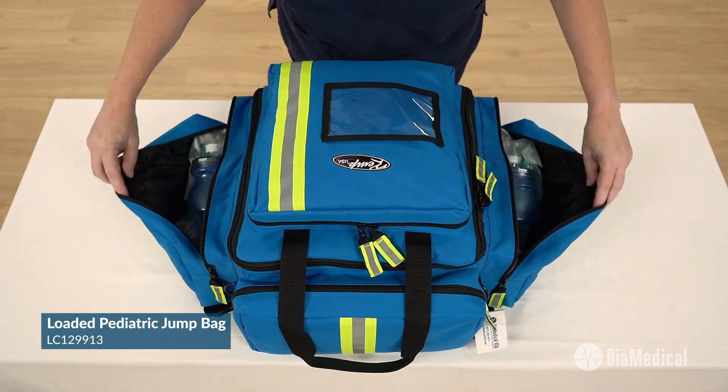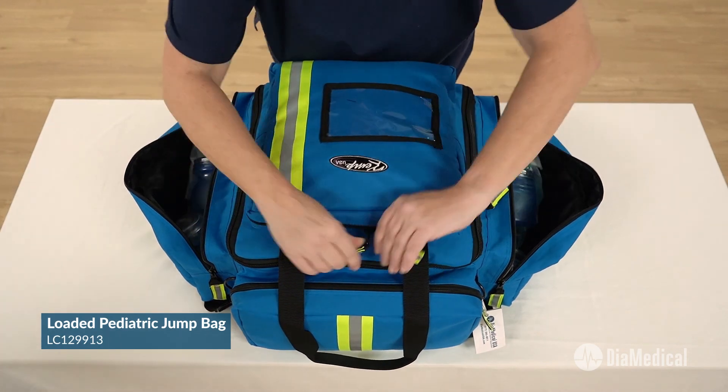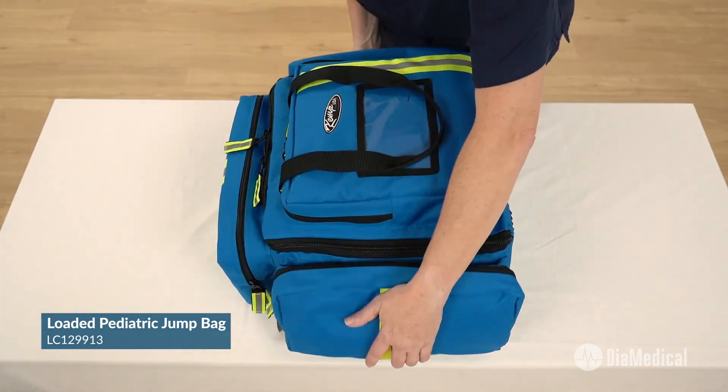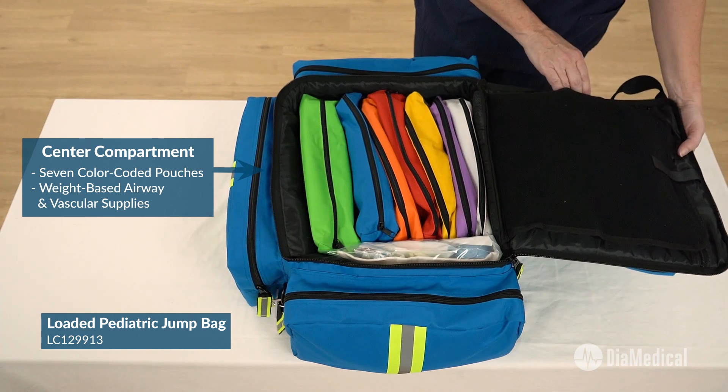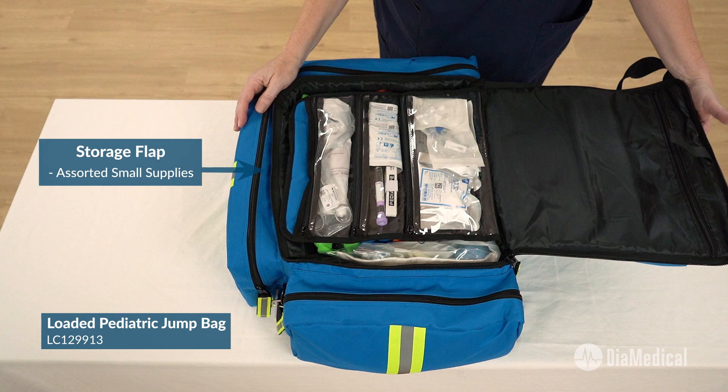The side pockets hold pediatric BVMs, blood pressure cuffs, and a stethoscope. The center compartment contains a set of seven removable color-coated pouches that contain weight-based airway and vascular supplies. There's also an extra storage compartment for smaller items.